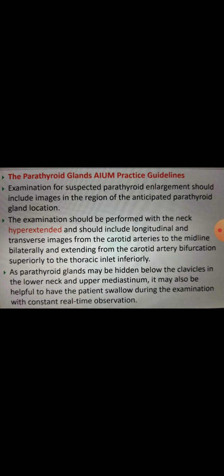Now we will talk about the practice guidelines for the assessment of parathyroid glands on ultrasonography. Whenever you perform the parathyroid examination, just remember that it is difficult to visualize the normal parathyroid glands.